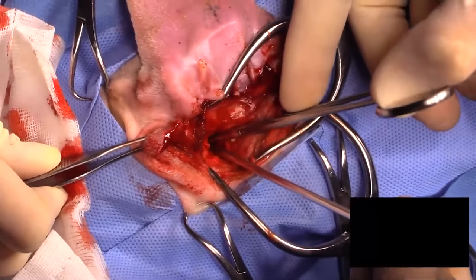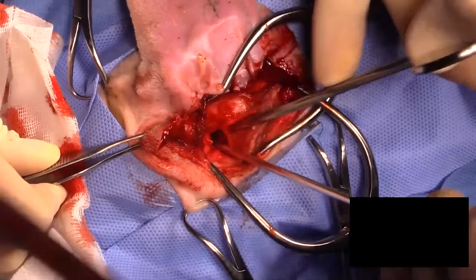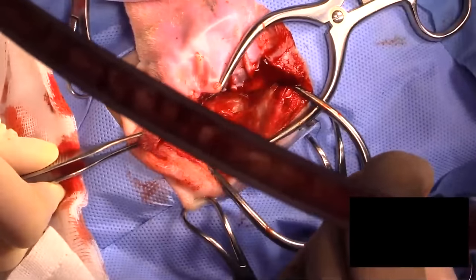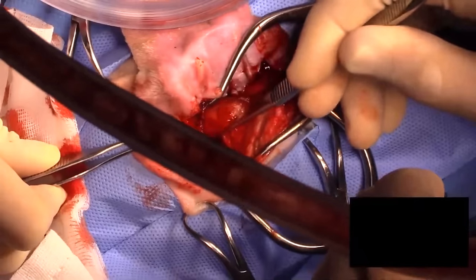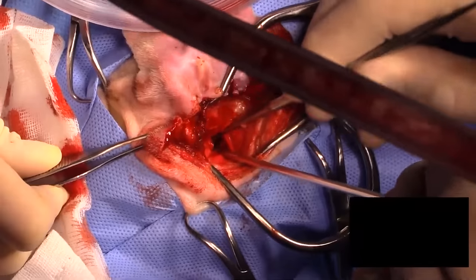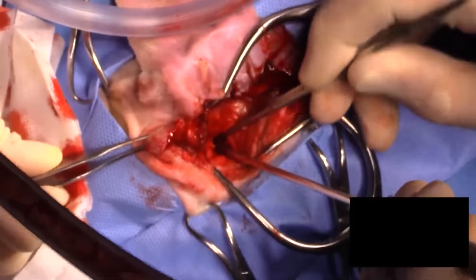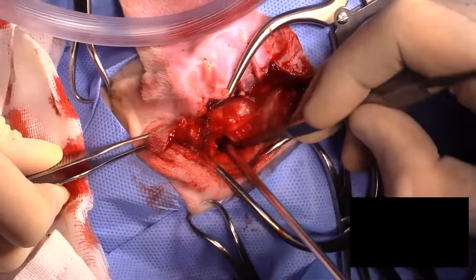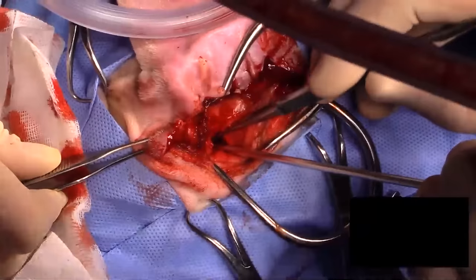If you're lucky, the whole lining will come out like a great step. Which is very gratifying. And you want to get down to white clean bone everywhere. You can see the top of the bulla through there, and stay away from there.